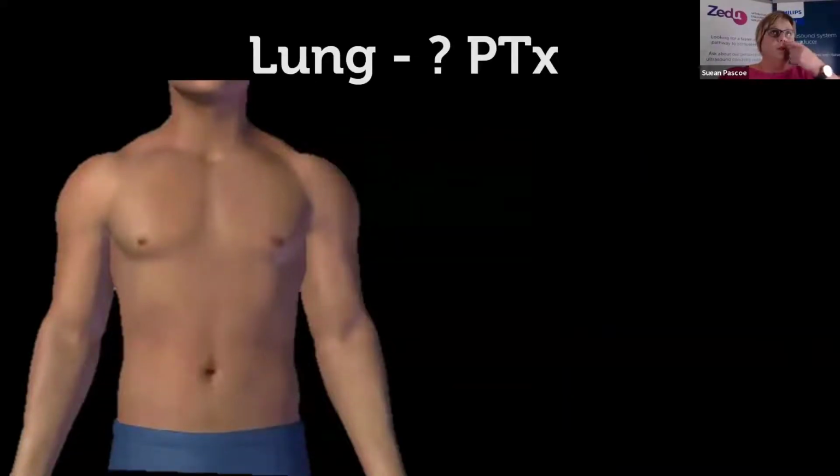So then we move on to the lung part of the eFAST exam. When we're looking at the tank, we're looking for compromise of the tank. And so we can look for pneumothorax. We pop the probe on in longitudinal. I always go in a longitudinal view so that I've got the rib shadows as round landmarks so that I can find the pleural line quite easily.